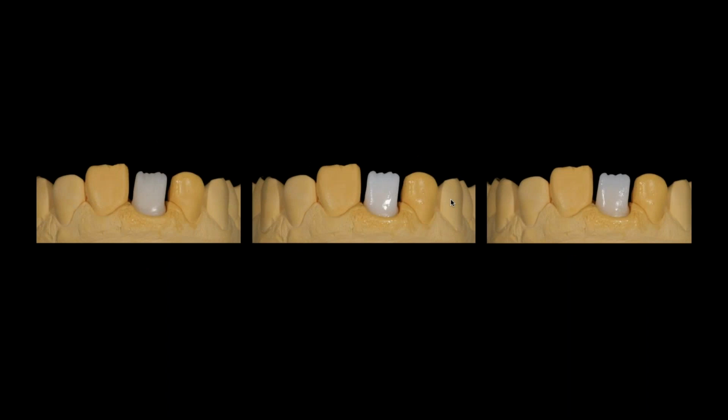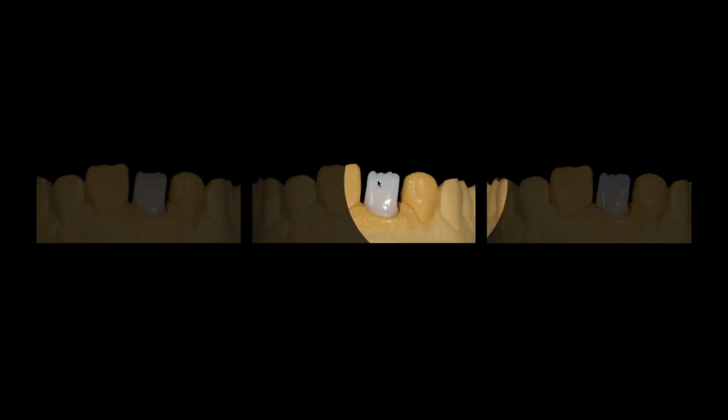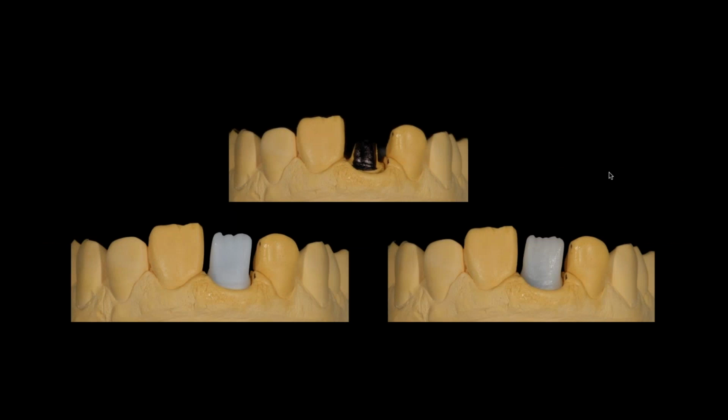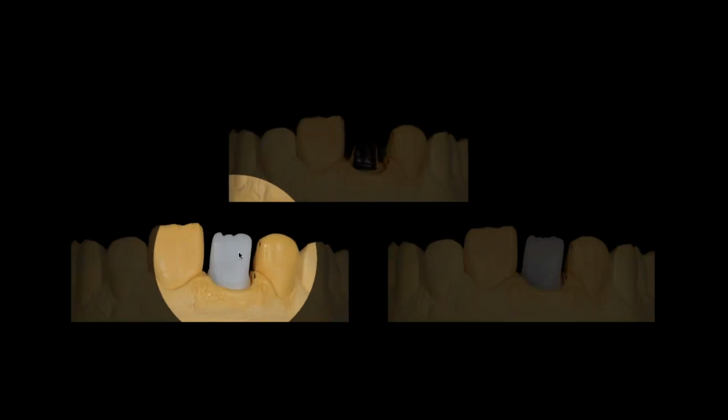And if I put them all on the cast, you can start to see the difference a little bit. Obviously, the colored one looks a little colored, and the brighter and the translucent, you kind of see the differential between them all. But where it really matters is what's behind that tooth. So if I blacken the prep shade with a black magic marker, like if there was metal or coloration on the tooth, and I put on 2 of the copings, what do you notice right away? Even the opacified coping, I'm still seeing the black and the gray kind of come through.